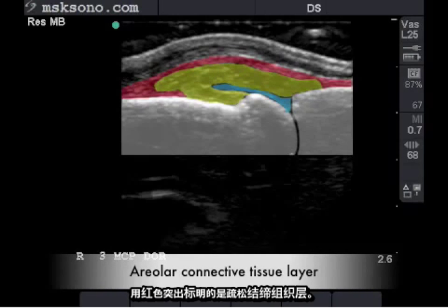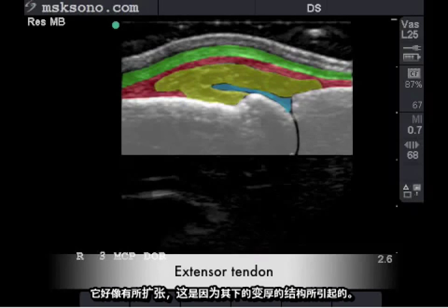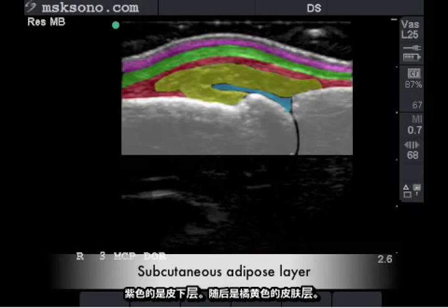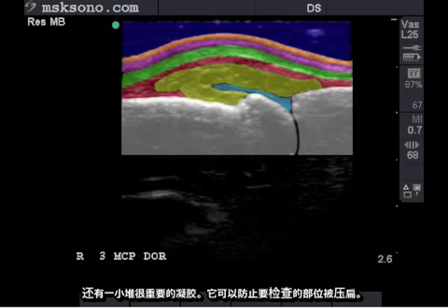Highlighted in red is the areolar connective tissue layer, followed by the common extensor tendon which appears distended due to the thickened structures beneath it. Purple is the subcutaneous layer, followed by the orange layer which is the cutaneous layer, and also the very important gel heap keeping these structures from being compressed.